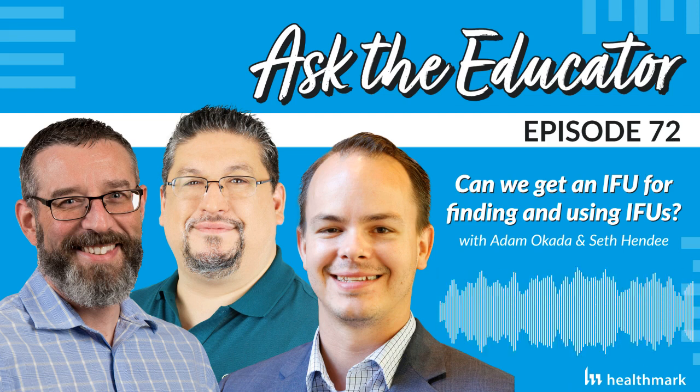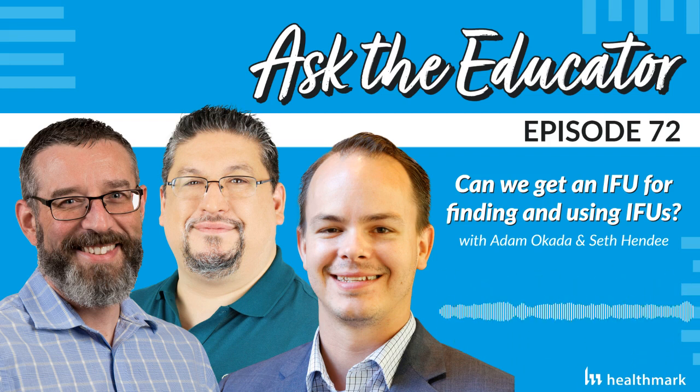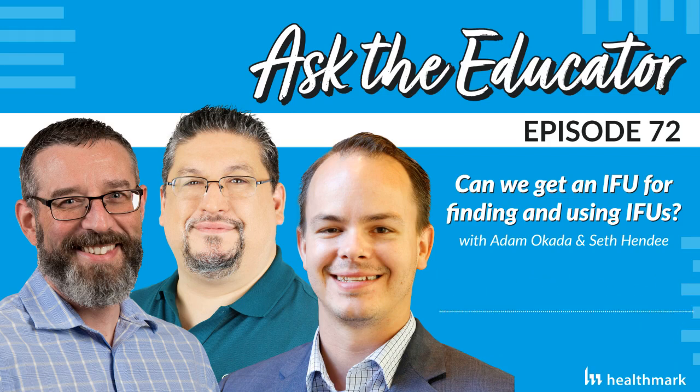So that is another step that we should be quizzing our staff on, whether or not they know how to do those things. Because guess what? Manager or educator or supervisor, whoever, sometimes they've gone home and then a loaner's dropped off and there's nothing else you can do. You have to be able to troubleshoot those situations on your own.